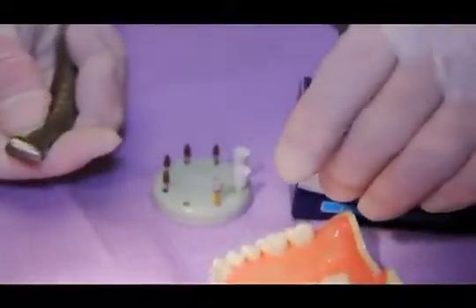So what we're also not going to talk about is how we do the gross finishing. Then we move to finishing, to polishing. And it's a little bit interesting as far as the sequence. The first thing we're going to do as far as margination and creation of these mamelon grooves that create beautiful natural light reflection is a brownie. Now we're going to use a traditional brownie. These are, I think they're about $1. We're going to use this.